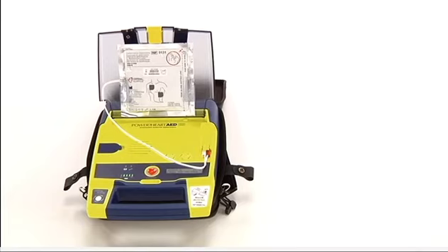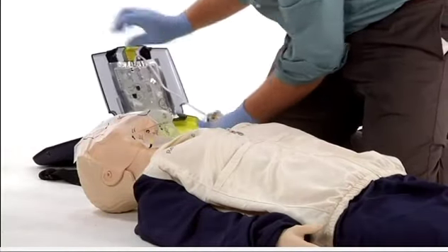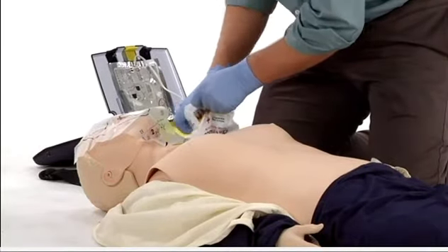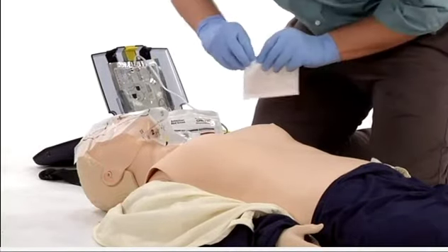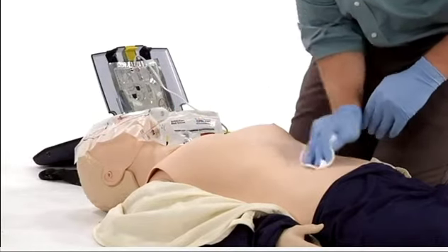Most AEDs can be operated by following these general instructions. Turn on the AED. The AED will tell you what to do next. Press pads firmly to patient's bare skin. Make sure the person's chest is bare and dry. Use a cloth or gauze pad to dry the person's bare skin where the pads will be placed.